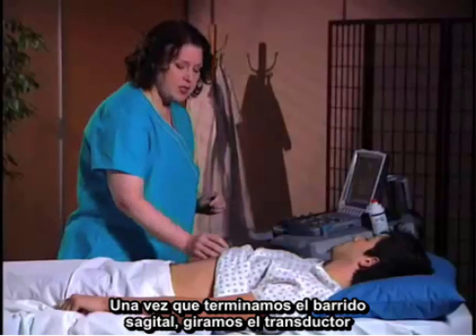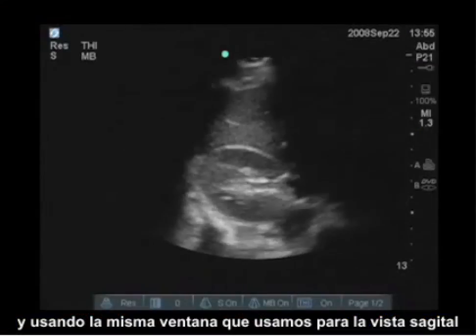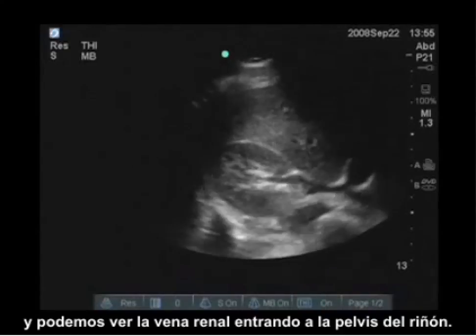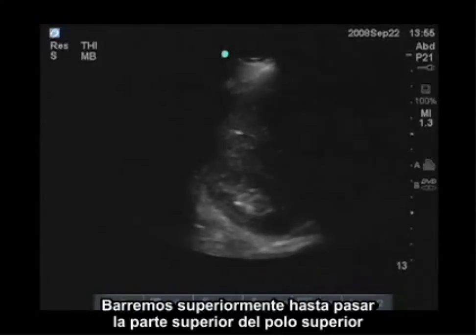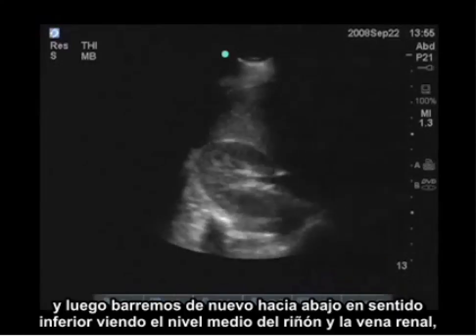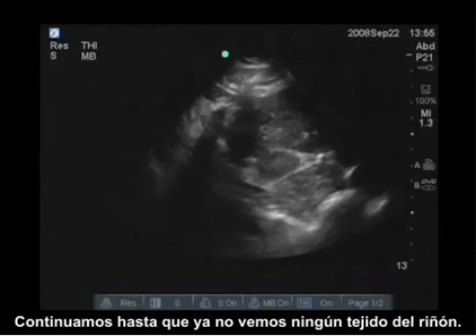Once I've finished the sagittal sweep, I'm going to turn the transducer to a transverse view with the marker to the patient's right. Using the same window as I did for the sagittal view, I identify the kidney, which will now appear as a horseshoe shape. We can see the renal vein coming into the pelvis of the kidney. I'm going to sweep superiorly until I move past the superior aspect of the upper pole, then sweep back down inferiorly, seeing the mid-level of the kidney, the renal vein, moving down a rib space, and into the inferior pole of the kidney, continuing until I do not see any tissue of the kidney anymore.